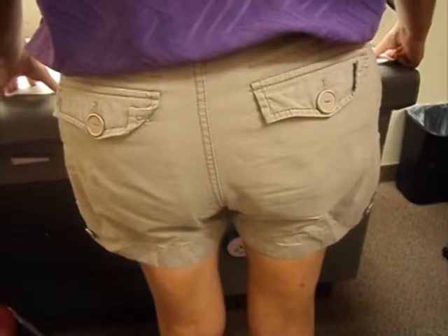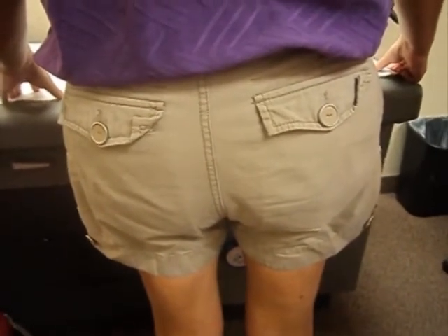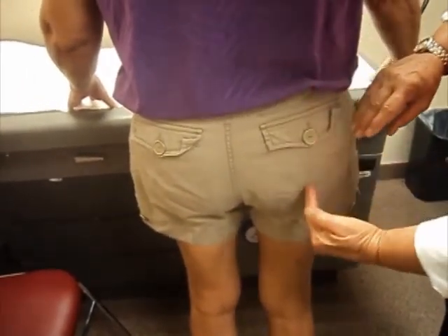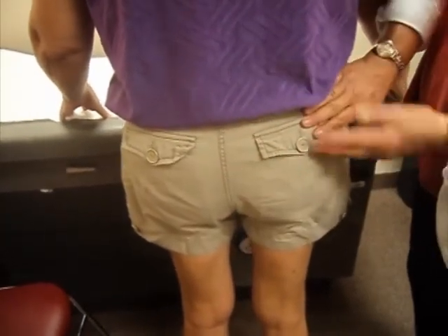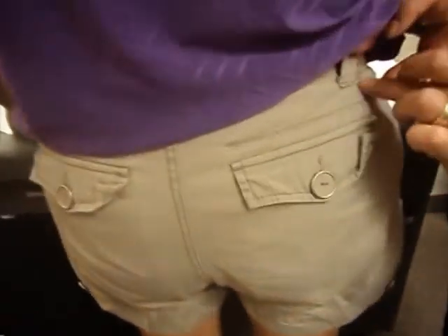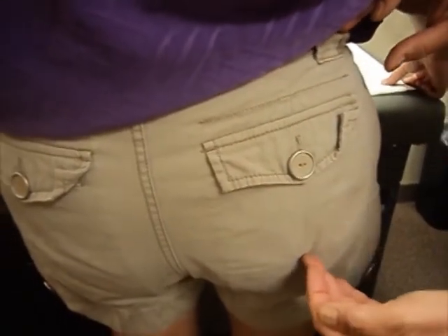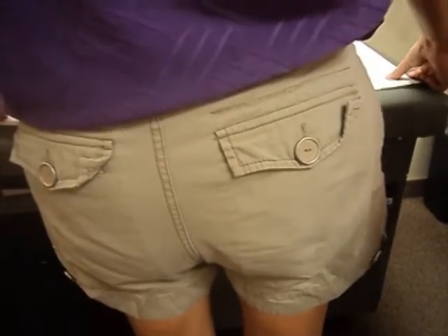The most painless body part to give an injection in is the buttock, and it's very easy to use. All you need to do is divide 1/2 of the buttock into four, like a checkerboard, and you're going to use that upper outer quadrant. And you can give your injection anywhere in that site, and you want to stay away from the middle of the buttock because there's a nerve running through it. So this is an excellent site to give an injection.